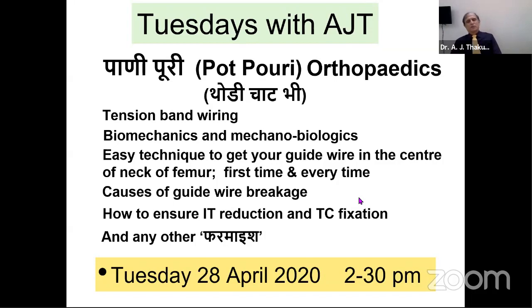If you keep the external fixator for a longer time, then one may have to wait in between as a change period, remove the external fixator, use some other immobilizer, and then go for the internal fixation. But if one is able to get on with other things within 2 weeks' time, then there is no need for a lay down period. You can remove the external fixator and use the internal fixators or nail or whatever straight away. So no hard and fast statement, but working on the condition that is available.